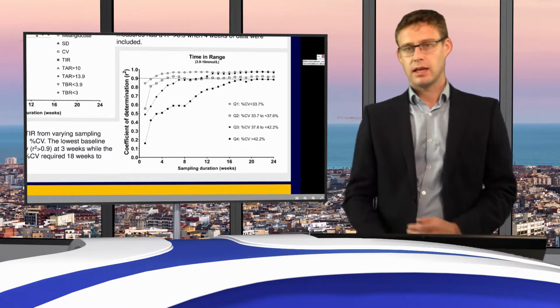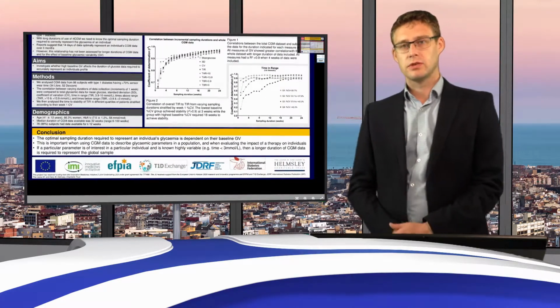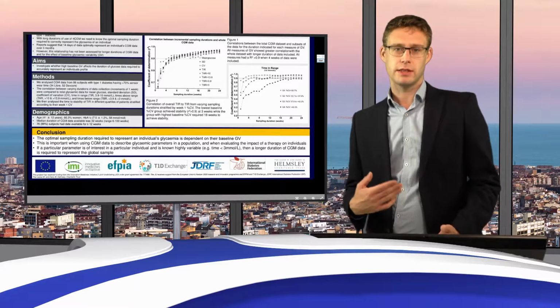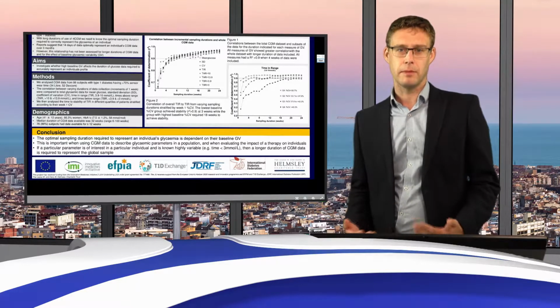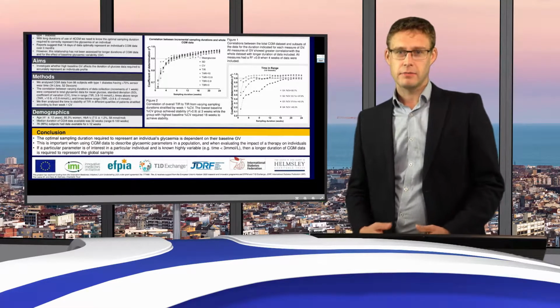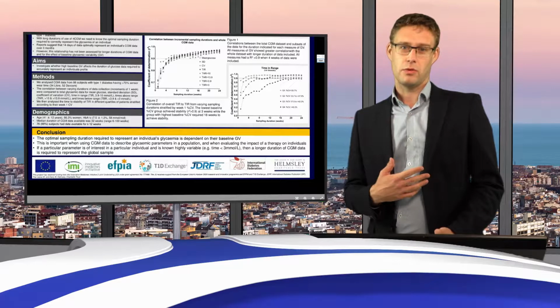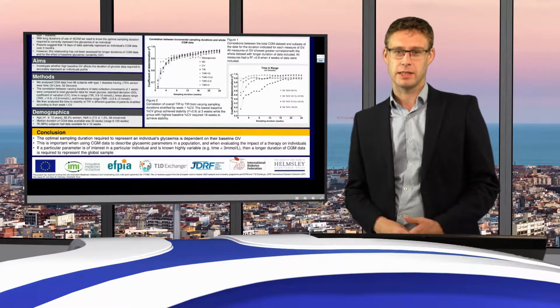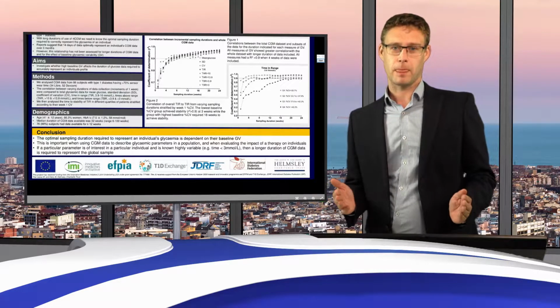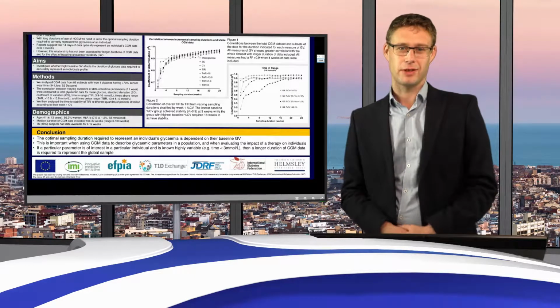We think that these data have some important implications. First of all, in clinical practice, an individual who has a high degree of glycemic variability will need to have a longer duration download, particularly if important therapeutic decisions are being made, such as changing modality of therapy. Secondly, in research studies, particularly those with small numbers of participants and in whom you might expect a high degree of glycemic variability, we might need to build in longer durations of CGM download if that's going to be used as a significant outcome measure within the study.